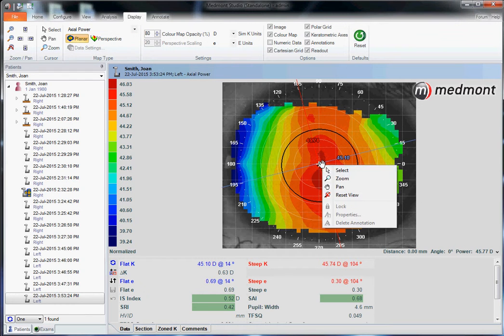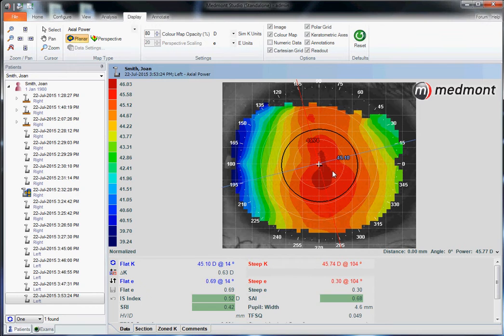Axial is the best way to interpret refraction or power of the eye. In this case, we see this patient has with-the-rule astigmatism. It's fairly regular in shape, distributed within the pupil. We would expect this patient to refract to a very high quality level of acuity based on this very normal anterior surface shape.